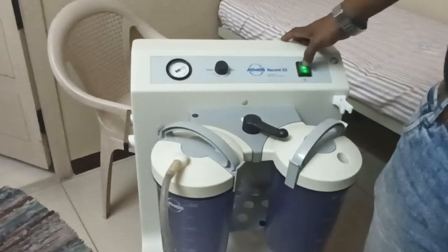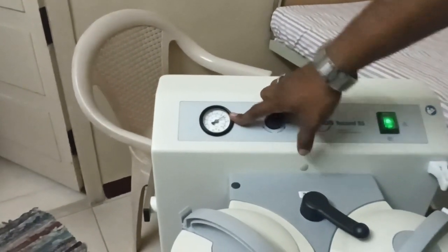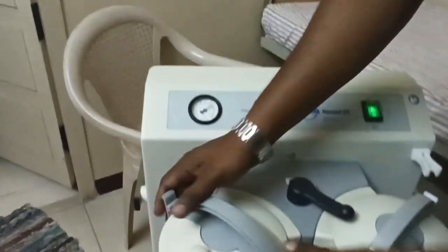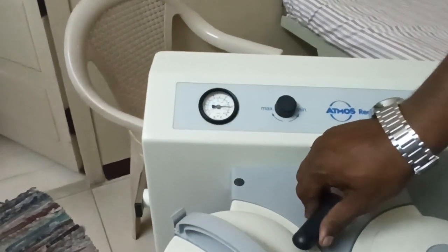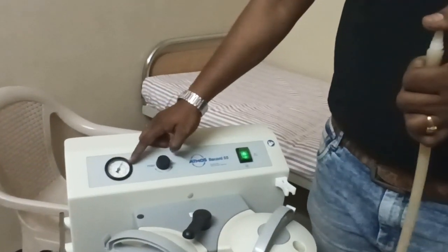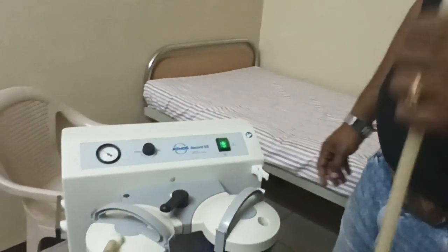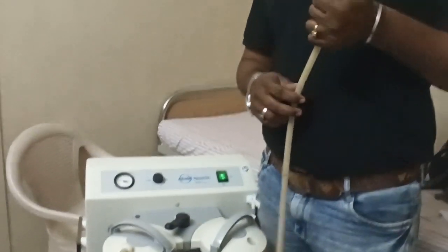Now I switch off and switch on again. You can see the reading is near 2, which means the new filter is good. When I close the tube, the suction power increases to maximum. So the filter was the major issue. Always remember: don't wash the filter, and while washing the machine, remove the filter first. Thank you.